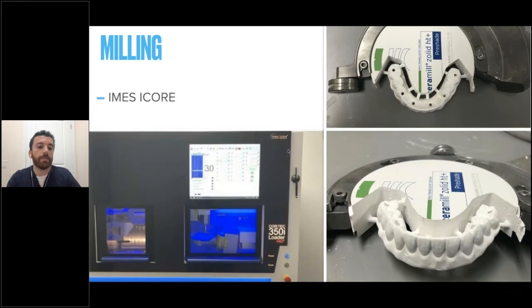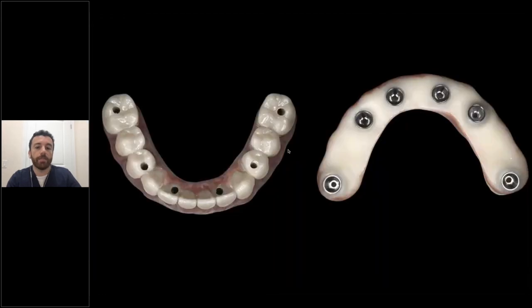This is the IMES-ICORE mill using the monolithic zirconia, like I mentioned. And this is the design of the final prosthesis. You can see we try and aim for a very flat or convex intaglio surface of the final.